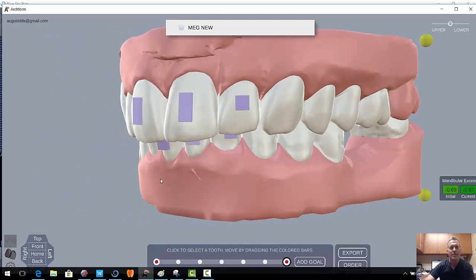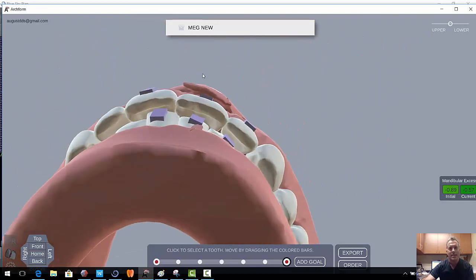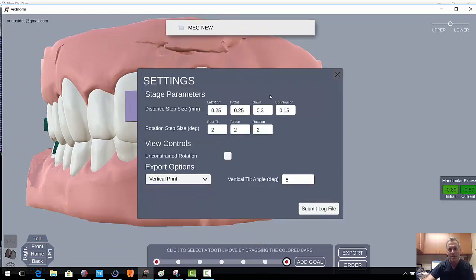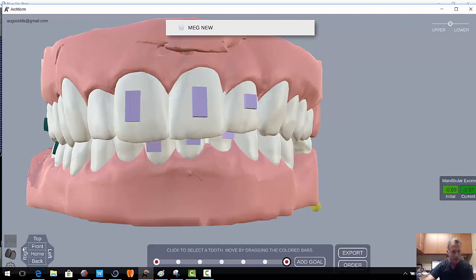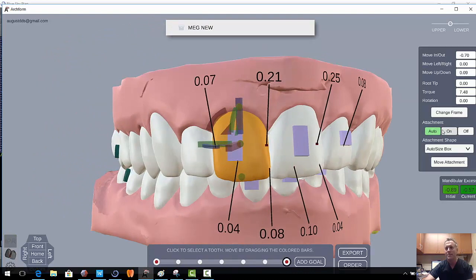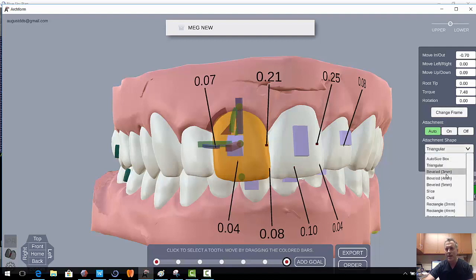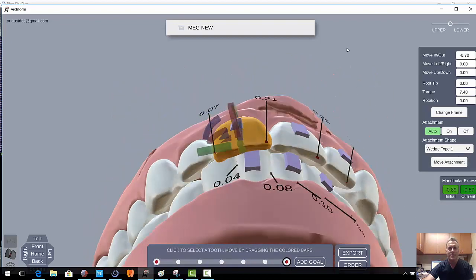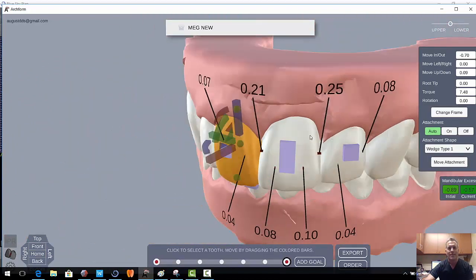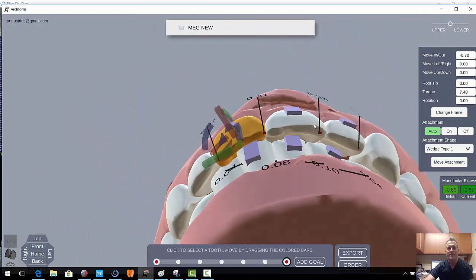So this is an attachment for mostly extrusion. This is a rotational attachment, and we have the attachments down here on these other teeth. If we want to change the attachments, we certainly can. Let's see, where do those attachments come from? Maybe we can, yeah. So on attachment, we can change the shape to triangular. We can change it to beveled. We can go ovaled, rectangular, and these all have different kind of type reasons for using them. Certainly something that could be discussed on a different video.